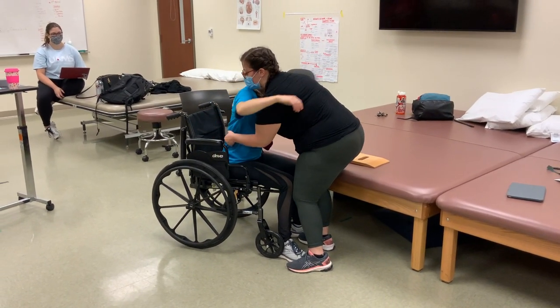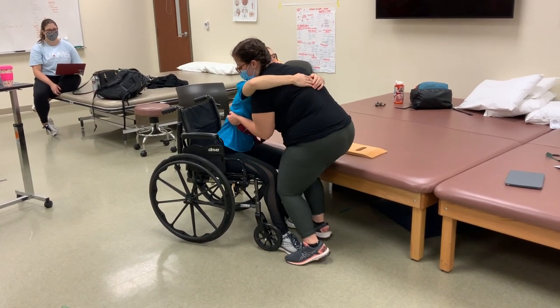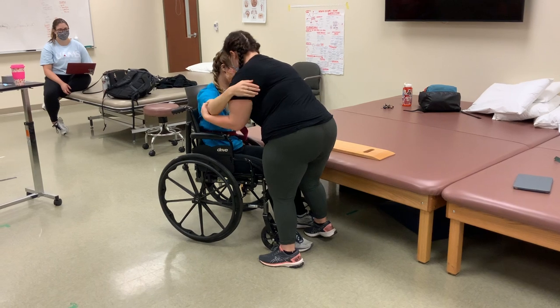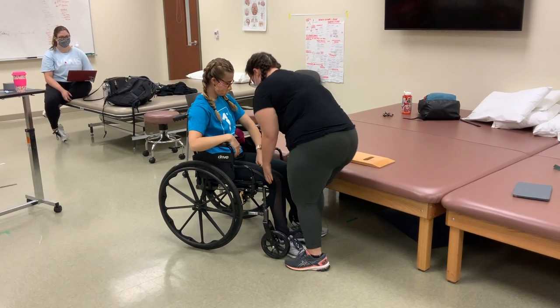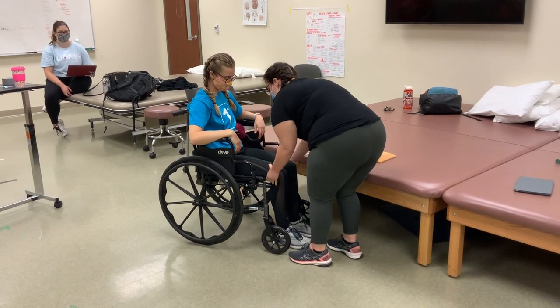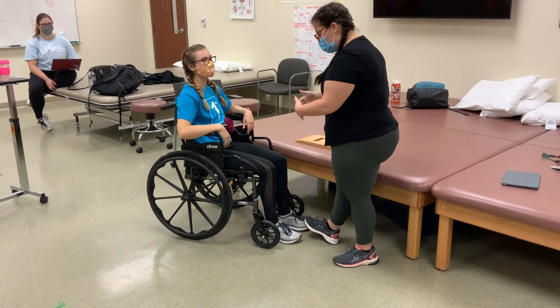Can you give me a big hug around my shoulders? I'm just going to scoot you back — one, two, three. Step back down. She's all the way back — looks good. Now I'll replace the armrest, and I will replace the footrest too.